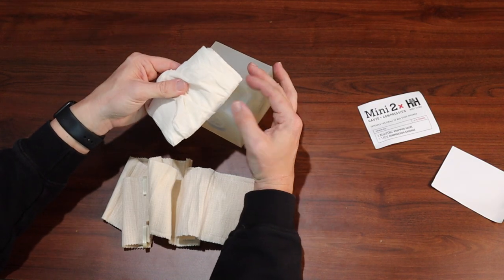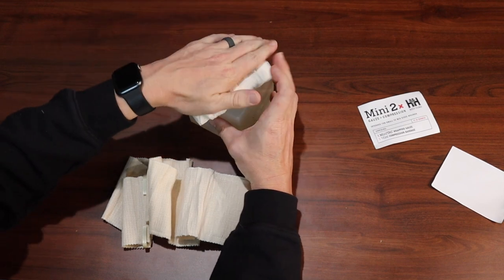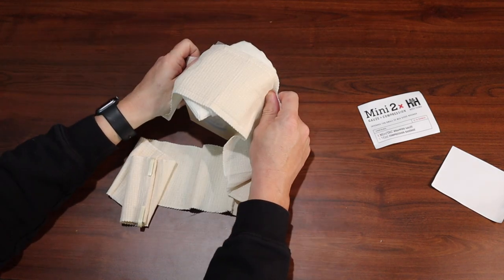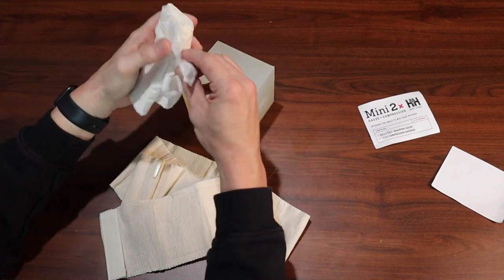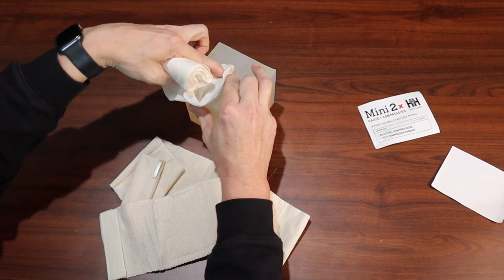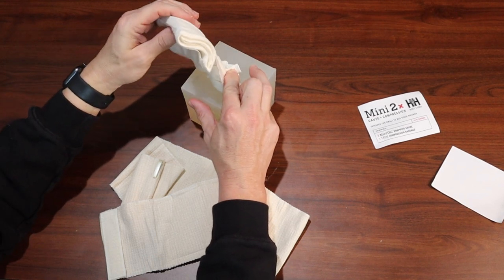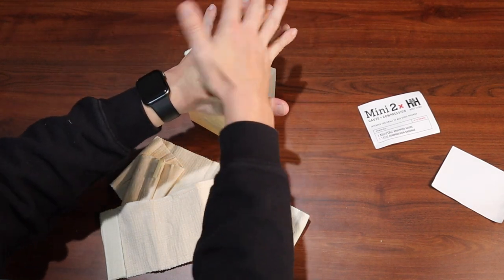Once we get everything secure, you could use the Mini-Tac gauze like traditional gauze. If you have a laceration, hold pressure for at least 10 minutes and then wrap it with your pressure bandage to control the bleeding. You can also wound pack with the Mini-Tac gauze — go in, find the source of the bleeding, hold direct pressure, put more gauze in there, holding pressure against the source of the bleeding. Once you've packed all the gauze you can into the wound, hold good solid direct pressure.